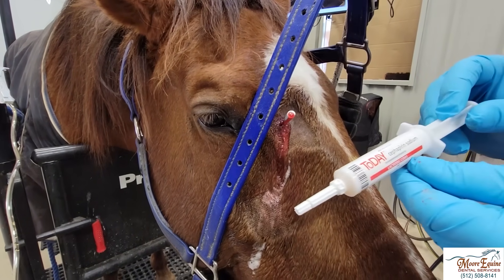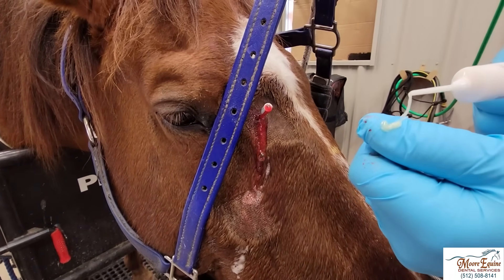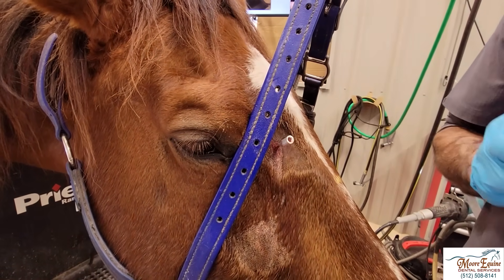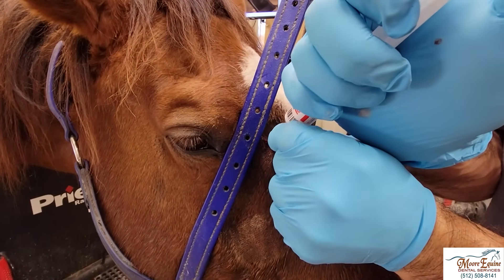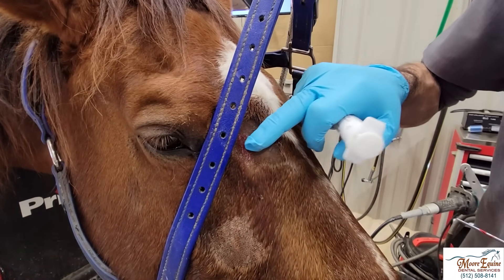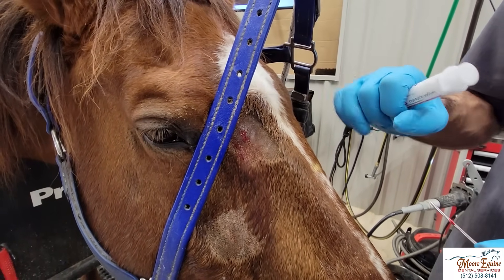Now what we're going to do is use a lactating cow antibiotic ointment — this stuff is pretty thick and has a nipple on it, so it's an antibiotic gel. I'm going to inject that directly through that 14-gauge needle right into the sinuses. I'm actually going to put two in this case — you're basically going to fill that sinus with local antibiotic. Then when that's done, you can just take the needle out. If you want to put a staple or something you can, but you honestly don't need to — that heals very fast. I just leave them open in case I need to do another one.